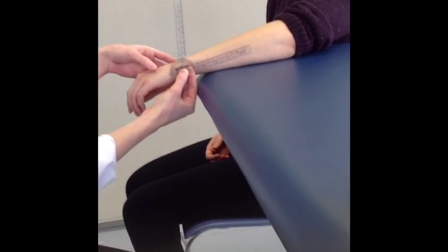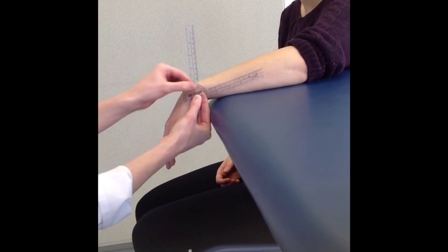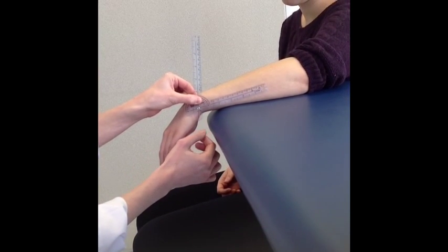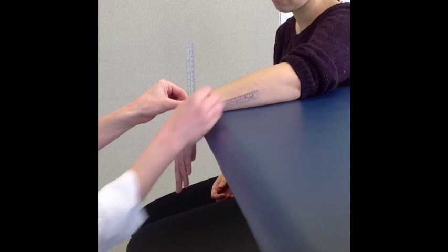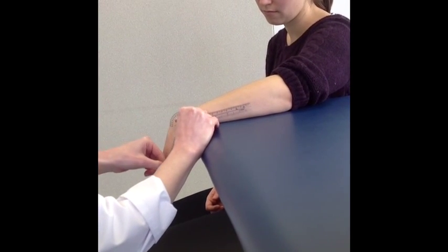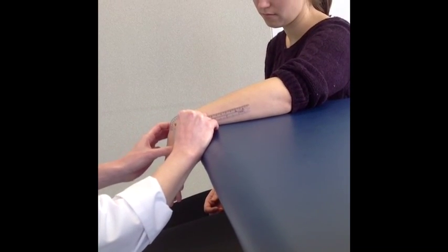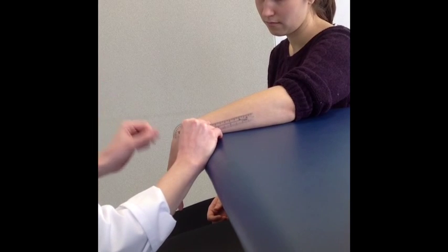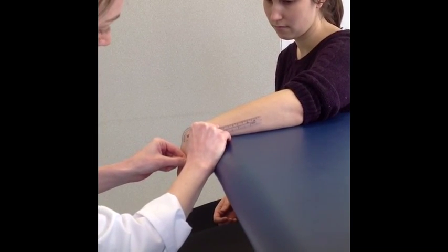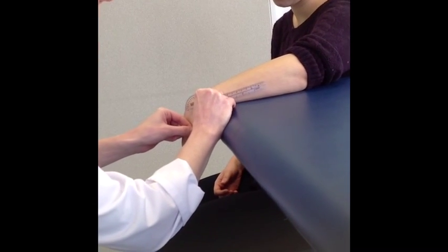For active range of motion, you're just going to ask the patient to bend their wrist down toward the ground. Make sure they're going as far as they can into that motion. You just bend all the way. Perfect. And we're going to line up the moving arm with the fifth metacarpal, and make sure you're lining it up with the bone and not the hypothenar eminence in the soft tissue there. So lining it up here. It reads at about 70 degrees.